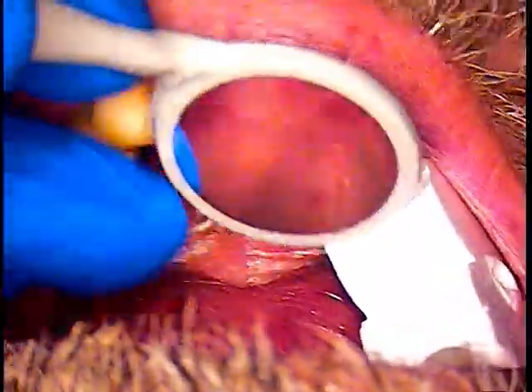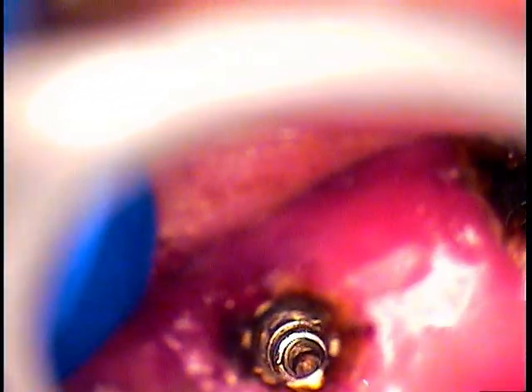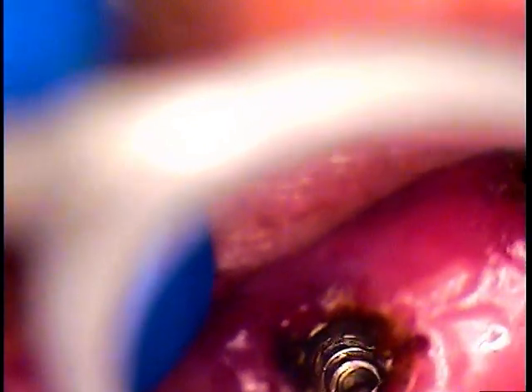Sure is a nice day to go in there without having to core drill. Boy, core drilling is a lot of work. That's because we see a lot of cases with Cavitron, cold weld locking them in. And so now look at how nice and clean that is. We're going to clean it up some more, so we'll pre-soak that again. You got the idea, right? Soak it in there nicely. There we go. And you can see how dark. See this? See what's in there? That's a lot of bad stuff. We want to clean that up and get that all nice, sparkling clean.